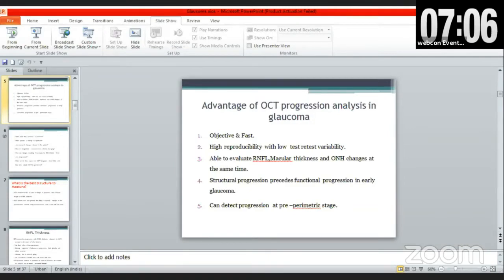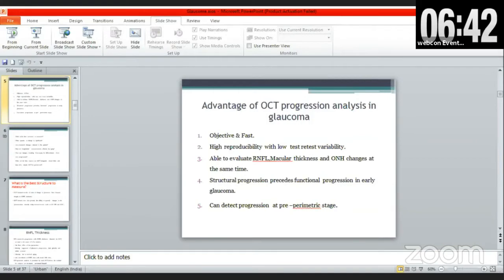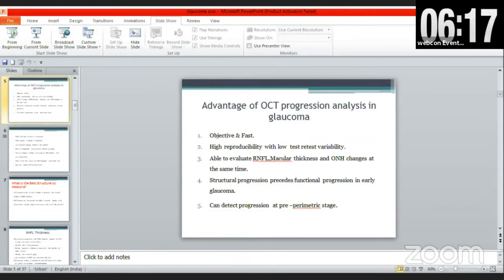The macular scan also has a role because the highest concentration of retinal ganglion cells is in the macula, contributing to glaucoma diagnosis. GCL and IPL measurements have excellent long-term inter-visit reproducibility. In advanced glaucoma, when the floor effect of the RNFL sets in, the ganglion cell and IPL thickness remains measurable. The ganglion cell analysis map shows normal range in blue, warmer colors as normal thickness, and deeper colors indicating loss of the ganglion cell complex.